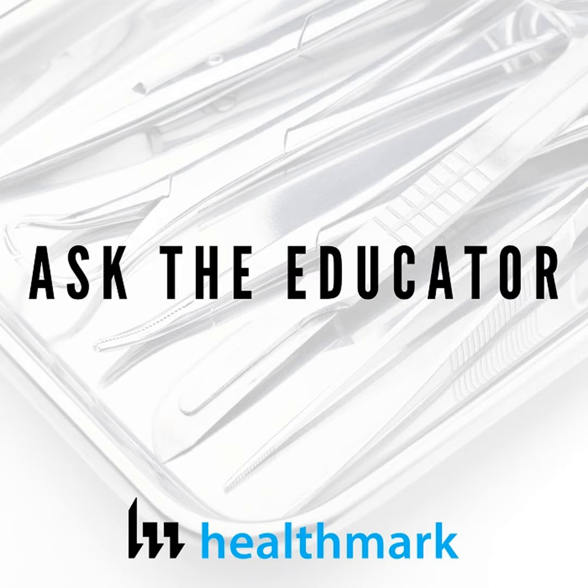The equipment, your washers, your autoclaves. We go into so many hospitals and they've got two washers and one of them's down. They've got 3 autoclaves and one of them's down, and it significantly hampers the ability to hit those goals. And then lastly, you've got to build some efficiency into that. So you've got those 4 variables that you're working with to get to these 3 goals.